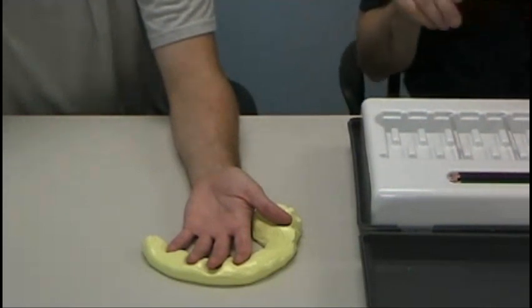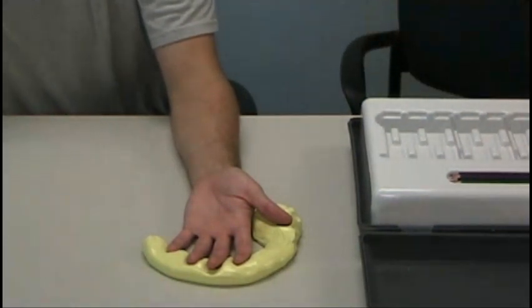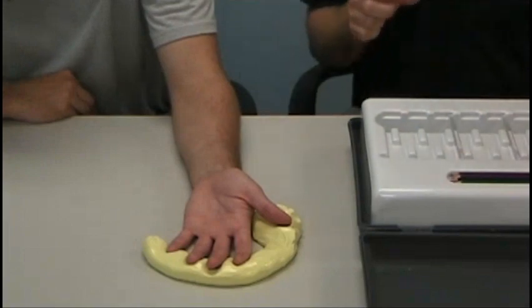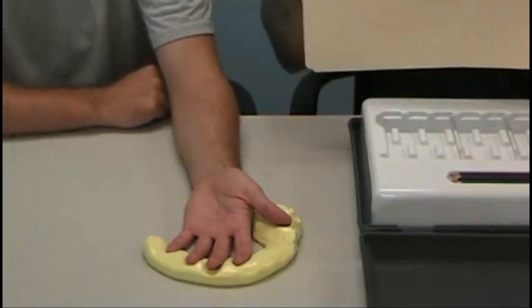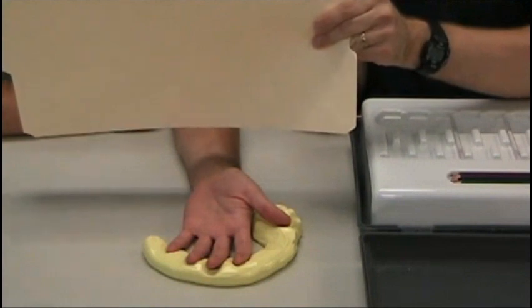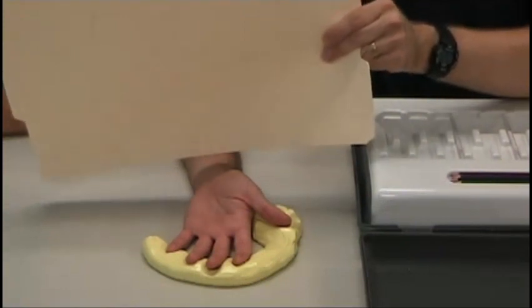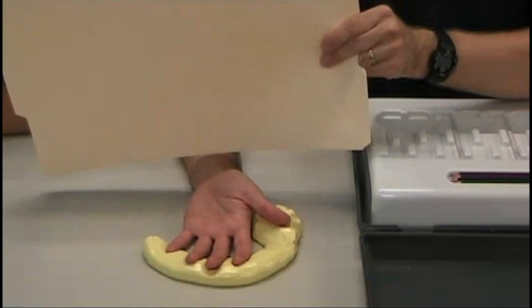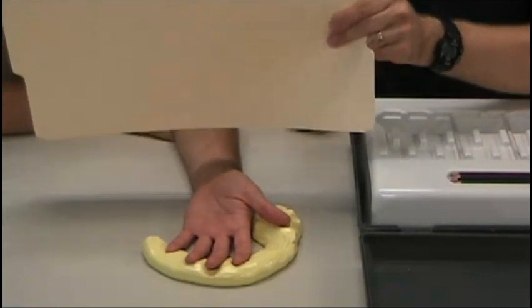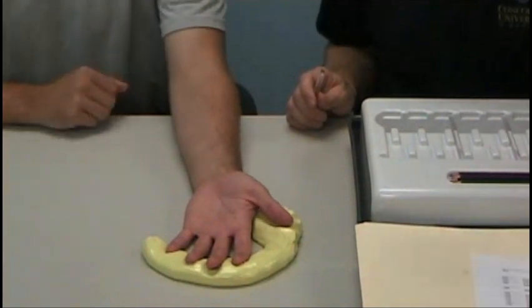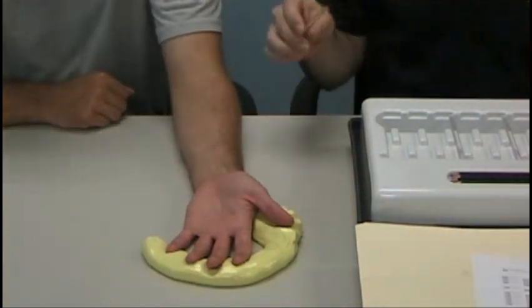Normally when doing this, you would use something to occlude vision. I usually instruct my patient to close their eyes and keep them closed, and I also use something to occlude their vision, like a file folder. It's important that you don't touch them on their wrist with this occluding object. If you're touching them on their wrist or forearm, that will alter the test. It will be very distracting to the patient trying to feel the monofilaments.